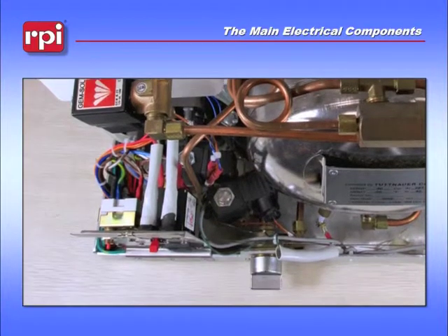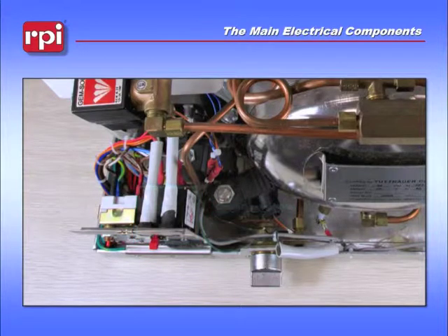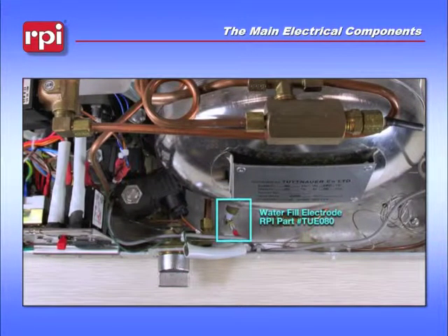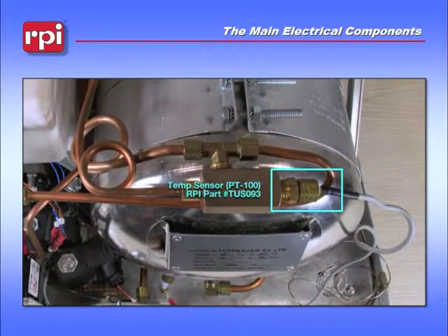Going back to the back bracket, you will see the circuit breaker with two fuse holders on top. Just to the right of that, you will see your exhaust/vent valve. And over to the right, just underneath the chamber, is the water fill electrode. Moving up to the T in the back of the chamber, you will see your temp sensor or PT100 sensor.